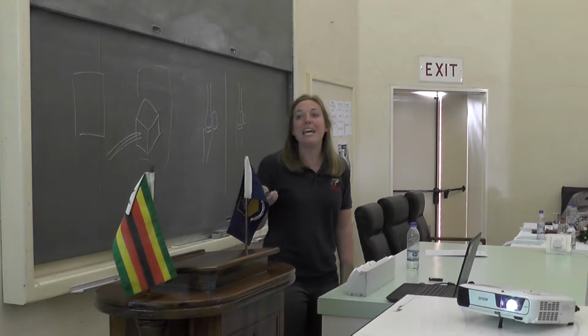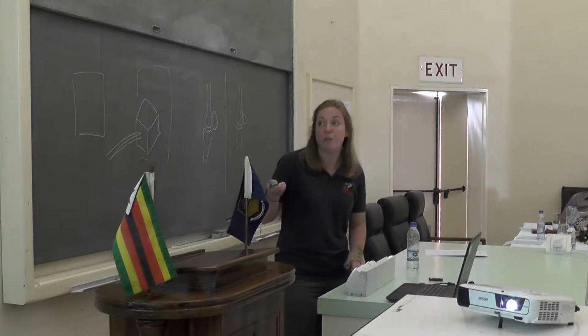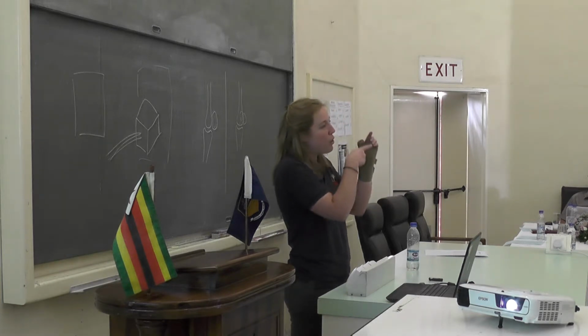And in terms of obtaining the view, you need to have X-ray vision in these cases and sort of imagine your anatomy inside the leg. So you see P3, P2, P1, and you want to image this joint here, which is the coffin joint, so between phalanx number 2 and phalanx number 3. And you ideally want to cut the joint. If you're looking at any irregularities or arthritis or any fragment, you want to be able to see that whole joint surface as clearly as possible.